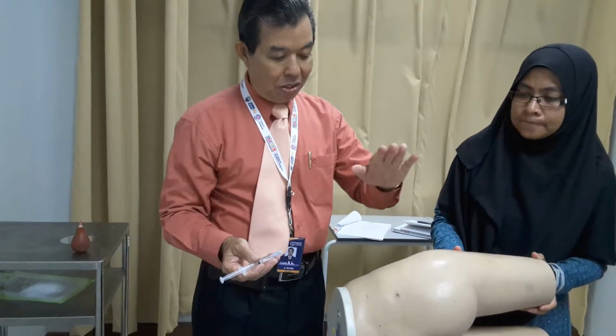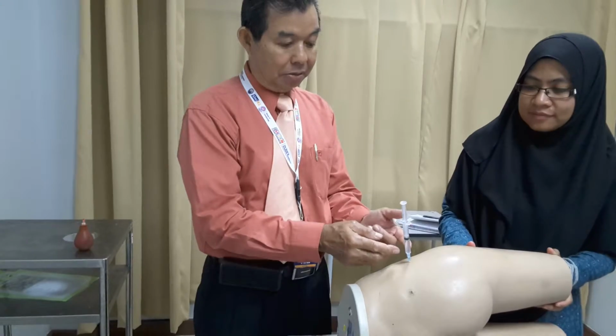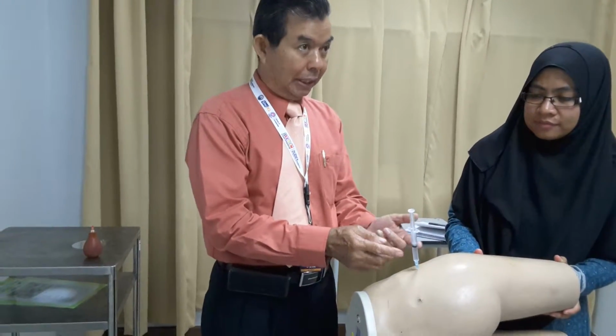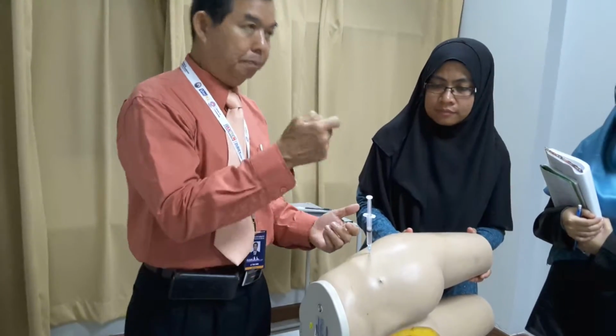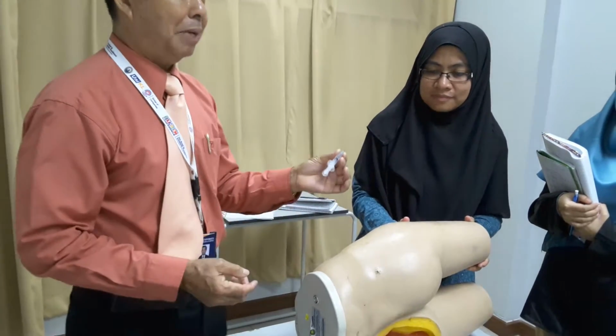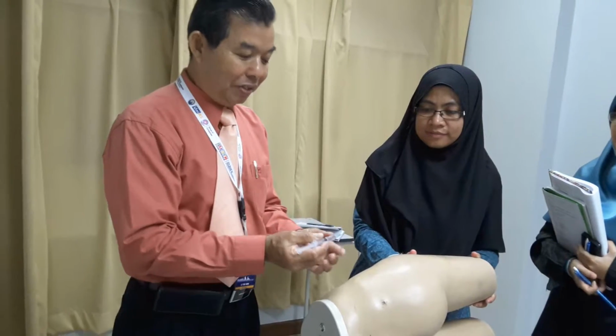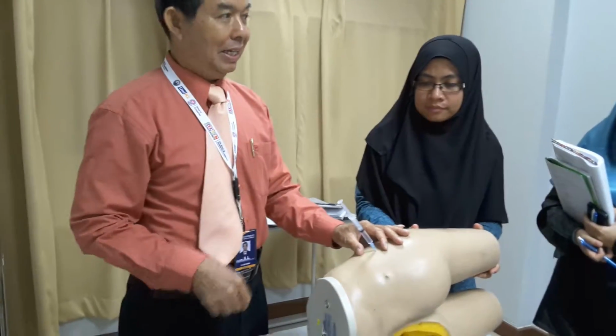Okay, let's see here. 1, 2, 3, 4, already in. 1, 2, 3 means the patient thinks that I'm just poking, but the fourth time, the needle is already in. Okay, I suck out to make sure that the needle tip is not in the artery or vein, so no blood may come in. By that time, you can pump in. That is my way. But for you all, don't practice my way. I've been doing it thousands of times, that's why I'm very confident. So for you, just do the ordinary way.